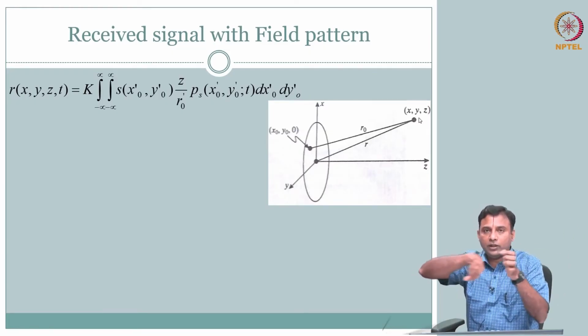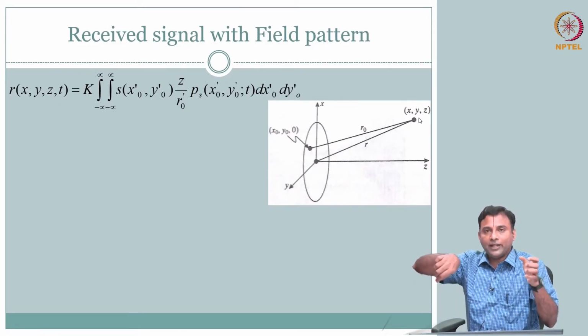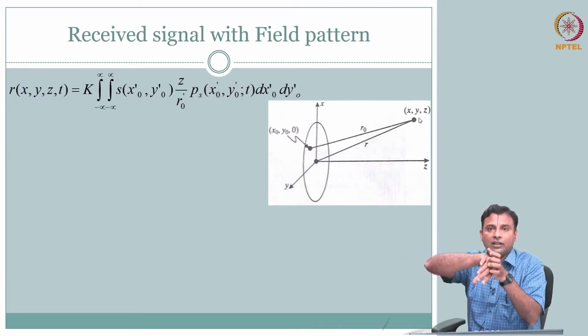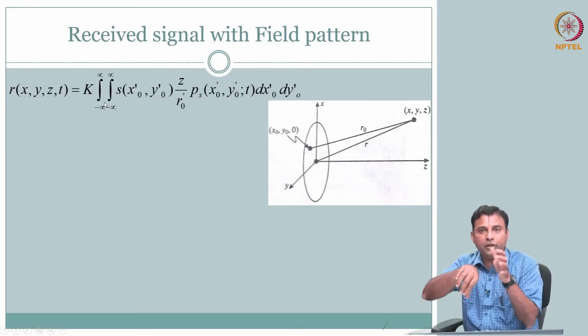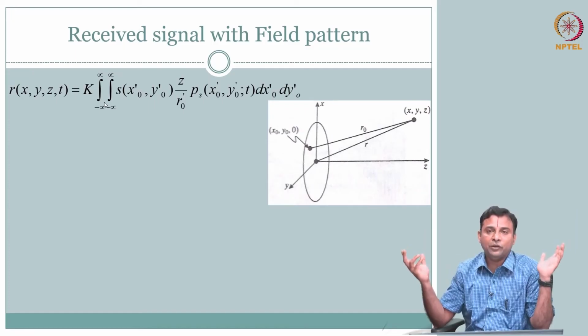So, this is going to oscillate, right, pressure wave. Whatever this spherical wave that is coming out, wherever it is hitting the surface of the crystal, all of the excitations in the crystal in the reverse are going to be summed, contributed. If it is not falling on the detector, that wave just went somewhere, we do not care about it.